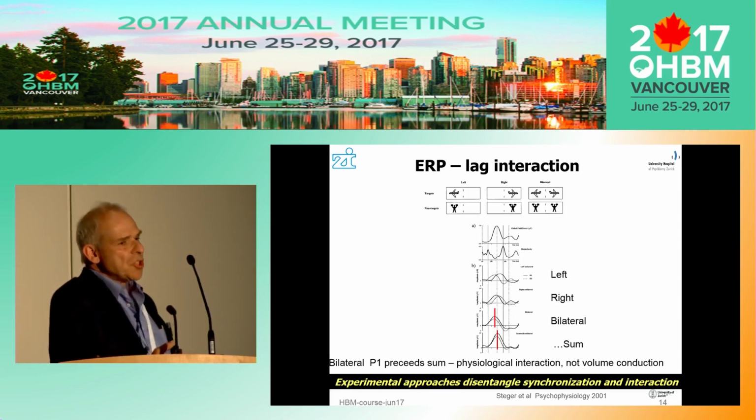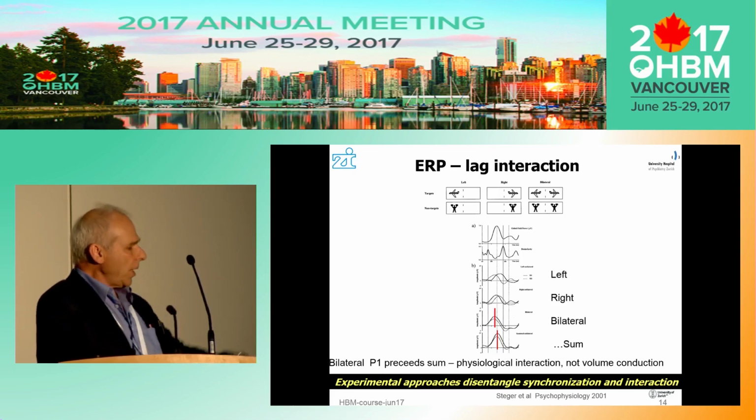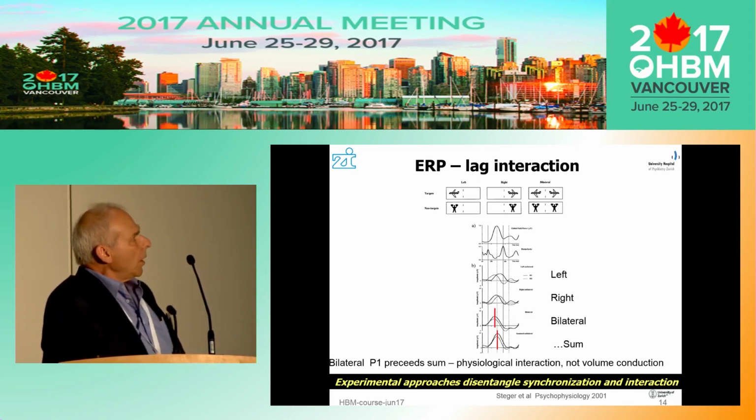So often if the question is whether something is explained just by volume conduction or just by a passive spread of activity, there are experimental approaches to tackle that. And this is from a very old study of ours where we looked at bilateral activation compared to unilateral activation.